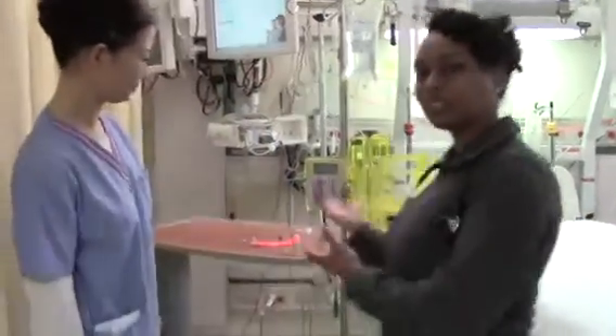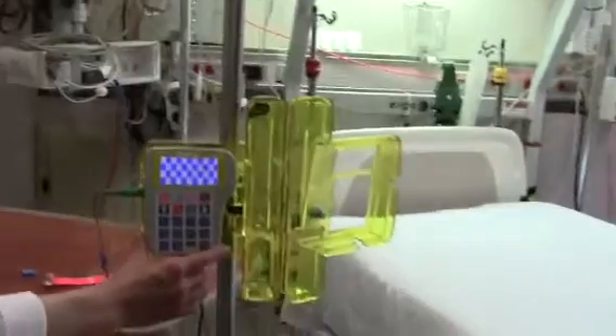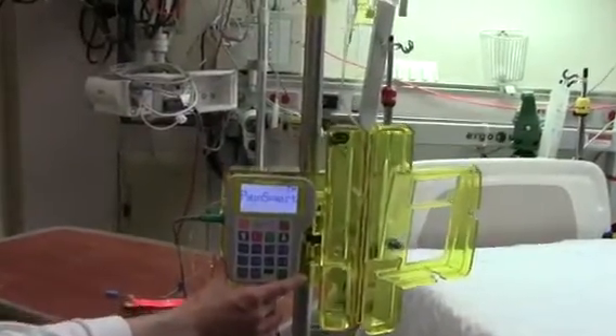The first thing we do is turn the pump on. Observe the self-test, the LED lights, and the power source screen.